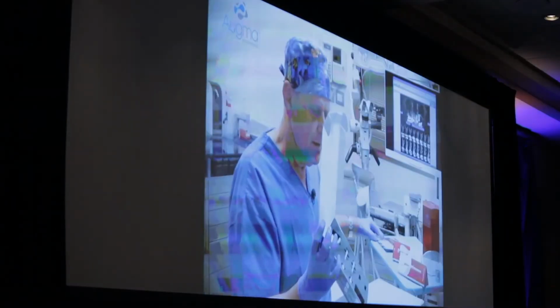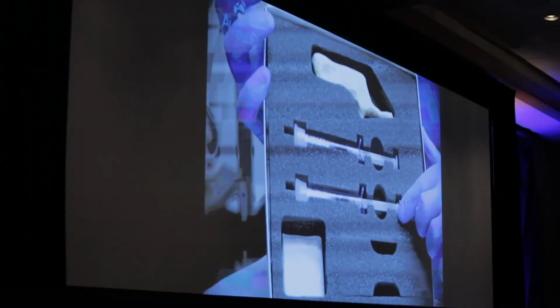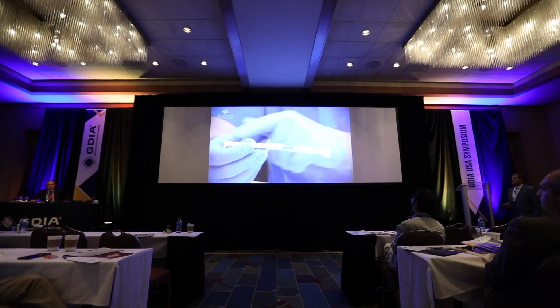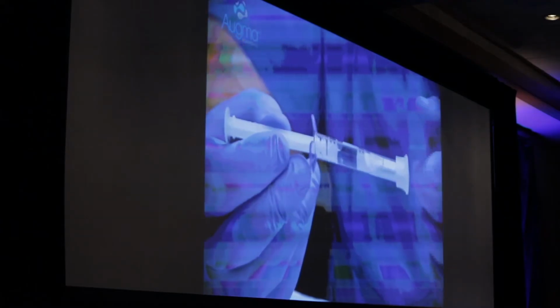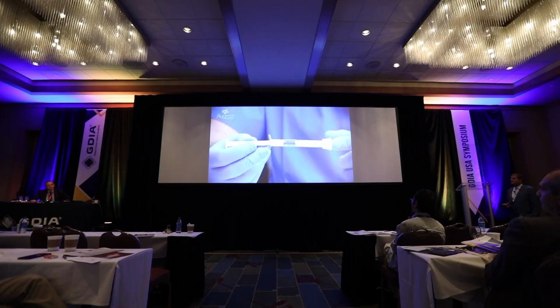The training kit includes a training manual, 2 demo syringes of bone apatite, and a mandible and dry gauze. So let's get started. This is the bone apatite syringe. It contains the powder, the liquid, a shaft, 2 pistons, a blue indicating line, and the syringe cap.